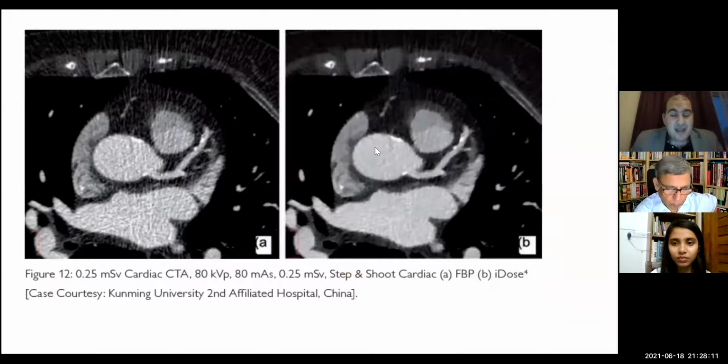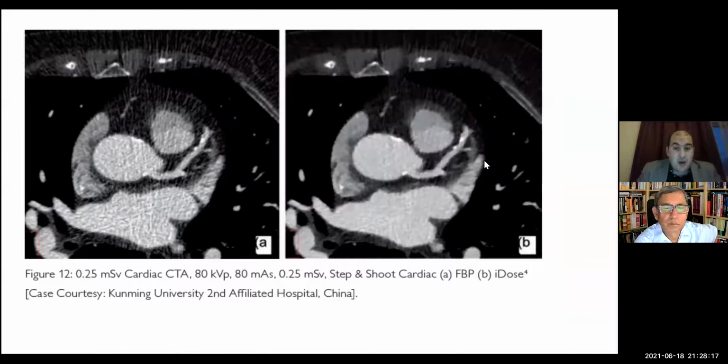So I advise all medical physicists to go through iterative reconstruction algorithms to get better image quality and reduce the patient dose. Try to design your protocol and ask yourself what you need exactly from the image, higher spatial resolution or contrast resolution, or what exactly is the clinical need of the doctors.